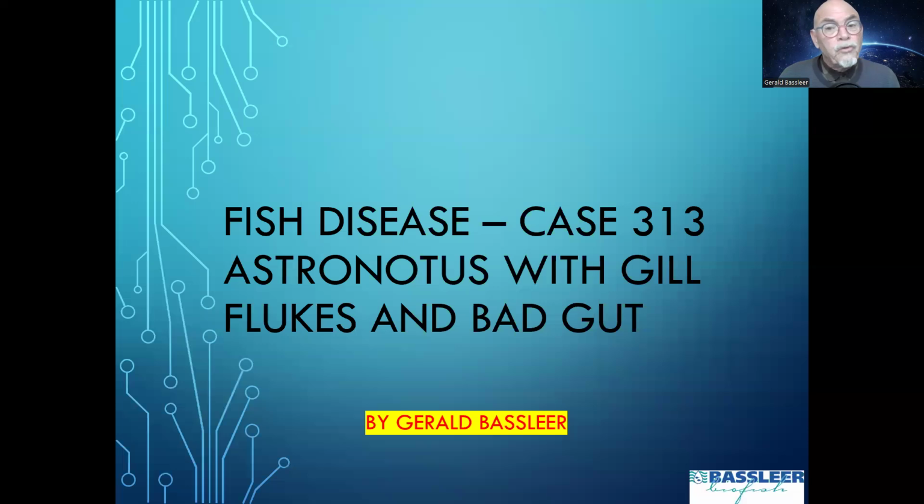So I will show you my findings so you learn to understand fish diseases, to learn to diagnose, to learn to treat, and especially maybe for those that like a microscope, try to use a microscope because that helps you in most of the cases to solve the problems. So, an Astronotus with gill flukes and a bad gut.